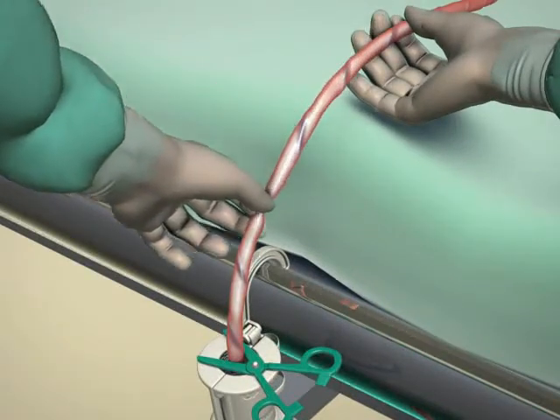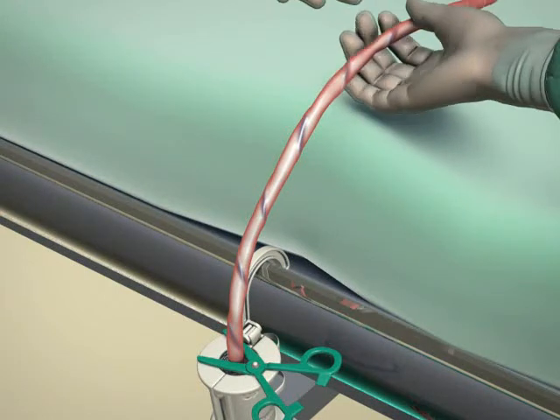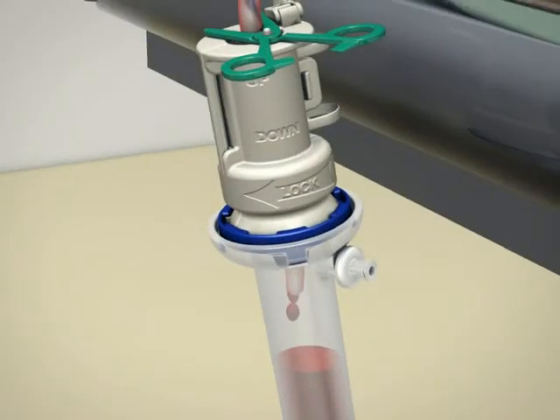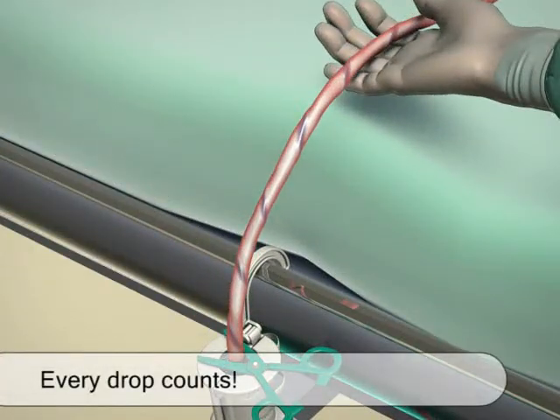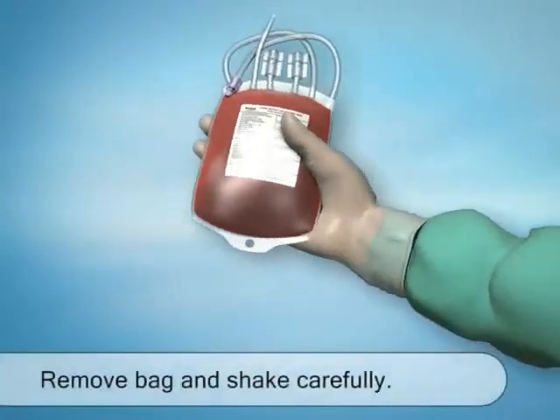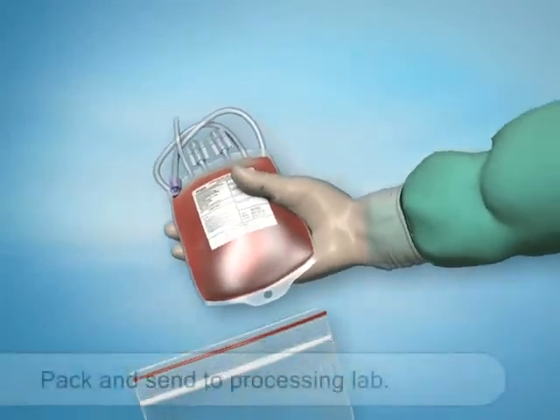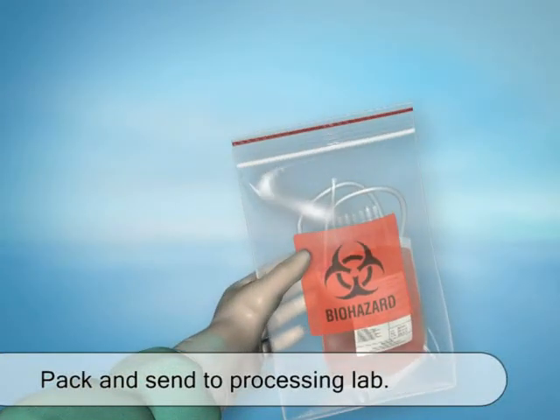During collection, it is essential to frequently milk the umbilical cord towards the device by holding the cord with one hand and milking with the other. Continue to collect as much blood as possible by milking the cord — remember, every drop counts. Once collection is completed, disconnect the bag and carefully shake it to mix the blood with the anticoagulant. Pack the blood-filled bag into the sealing tape bag and forward it to the lab as required by procedure.